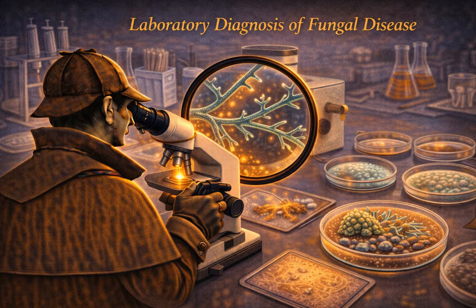We call this the silver standard. It really is. The chemistry here involves silver nitrate. The silver actually precipitates directly onto the polysaccharides in the fungal cell wall and turns it black, pitch black. And they usually counterstain the background tissue a light pale green, so you get these incredibly crisp, black, high contrast outlines of the fungus against the soft green background.